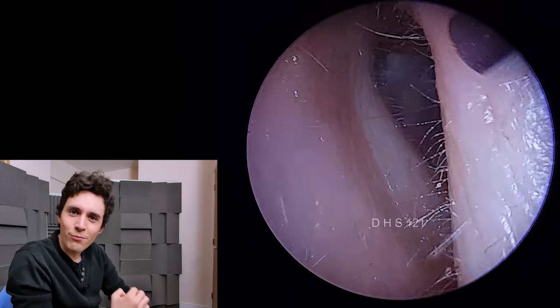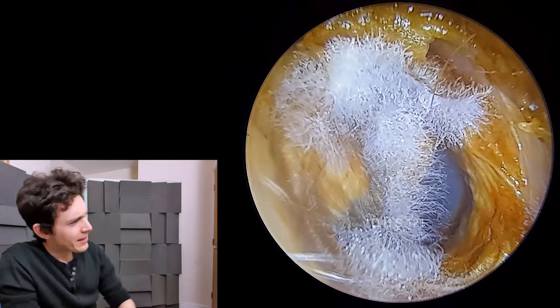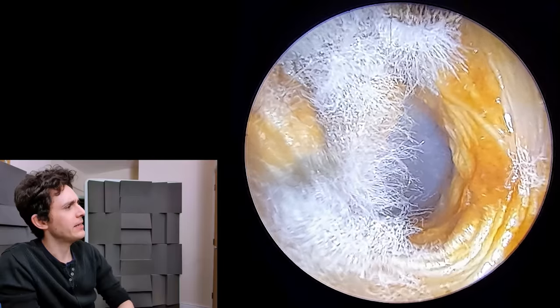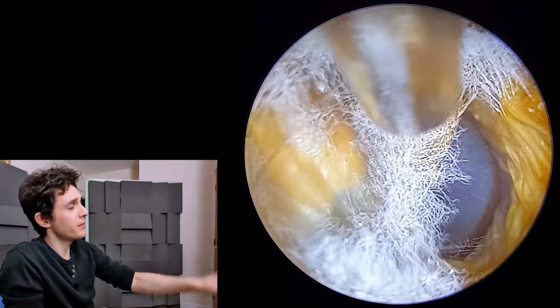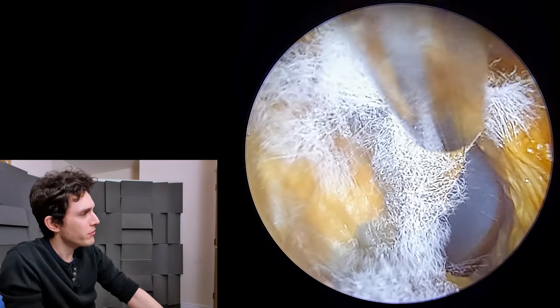Hey everyone, it's Connor here and welcome back to another video. I hope you're doing well. What we have here is a very interesting case. You can see this white furry stuff in the ear. This is a fungal infection and the fungus has very clearly developed on this dead skin and earwax and is feeding off of it.